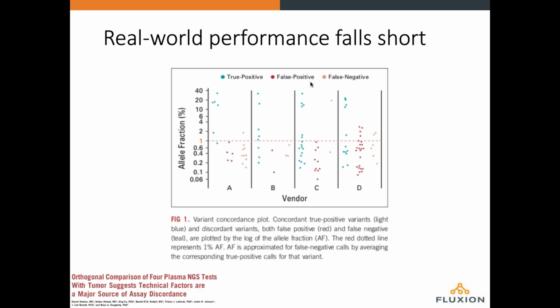Now, I should point out that this is a challenging population. It's not necessarily very late stage cases, but it's definitely a representative diagnosed population, not pre-diagnosis. And if you look at this, you see that we still have quite a ways to go when using this current state-of-the-art technology with well-developed commercial tests before we can confidently detect variants below 1%.